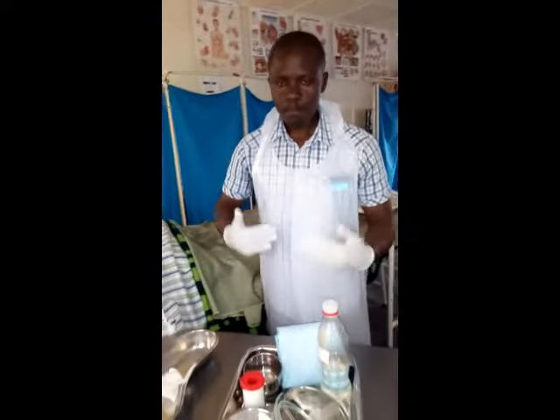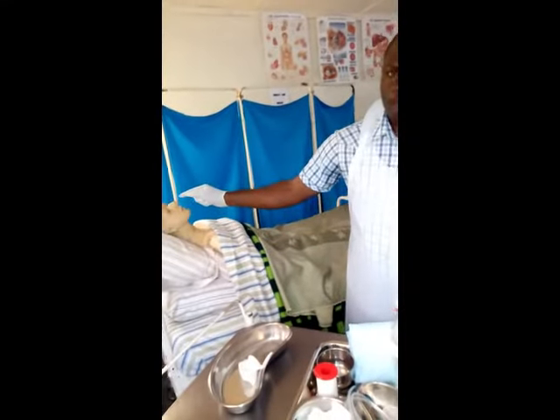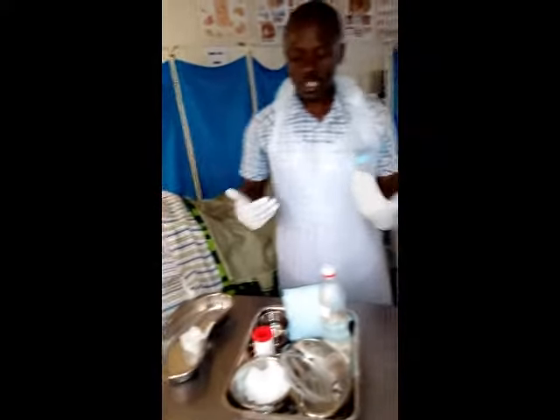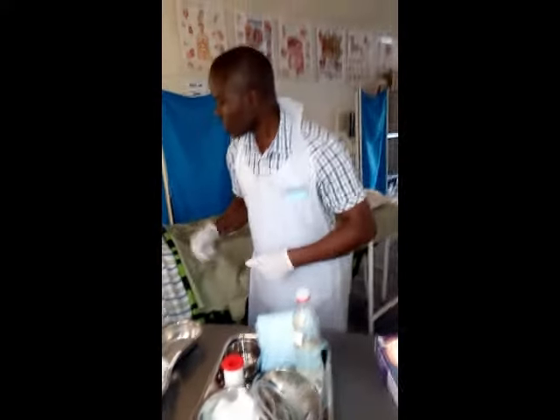That's another critical point. Okay, so these are some of the points that you should note for testing the nostrils. Okay, for making up the patient setup. Those are the points that will give you marks. And even when you're practicing on the ward, you need to do just that. It will help you. So let's now measure.